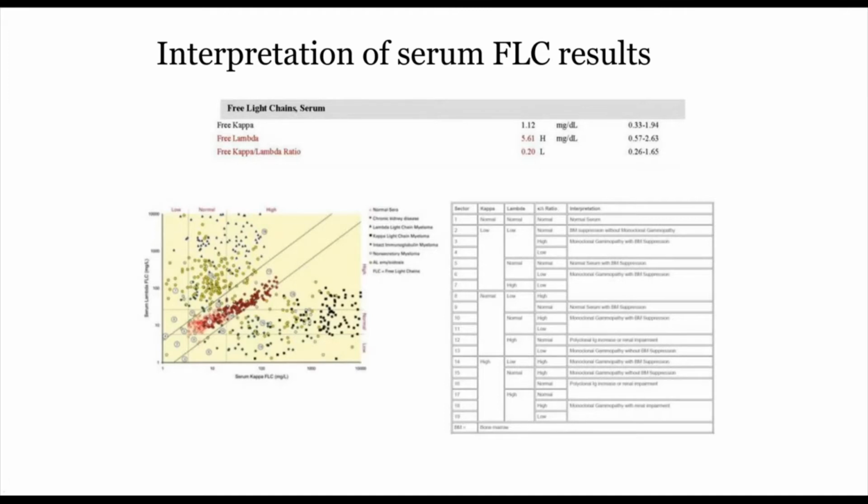If you're not careful with the binding site assay, you can end up with antigen excess as well. I published on this before, but those are relatively rare. The reason is that they have an instrument, I'm blanking on the name. It used to be the binding site SPA, but now it's the OptiLite. The OptiLite is programmed specifically to prevent the antigen excess. So all the binding site assays are run on the Optilite, which is specifically programmed for running the binding site assays and also to prevent the antigen excess issues that could potentially be encountered.